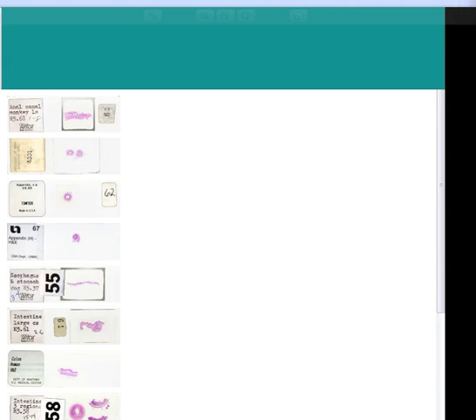Whoa, what's happening with me? I can't believe I didn't check this out better. Here, let's do this one. 4663. Okay, we got some good stuff now. Okay, I'm going to ask anybody to tell me as soon as they see the tissue under the microscope.